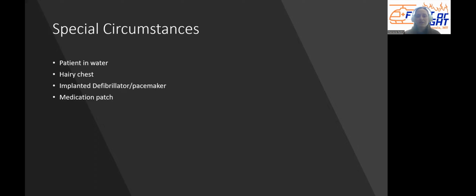Now remember, these are transdermal or transcutaneous patches, meaning they deliver medication through the skin. So I know we talked about PPE at the very beginning of CPR, but especially make sure you're wearing gloves when you remove the medication patch. If you touch the medication patch with your bare skin, you're going to get a dose of whatever medication that was. Could be birth control, could be nicotine, could be fentanyl, could be nitroglycerin. You really don't know what kind of day you're going to have after that. So I would make sure you're wearing gloves so you don't get exposed to that. And then just wipe the area if there's any sticky residue left on their skin.